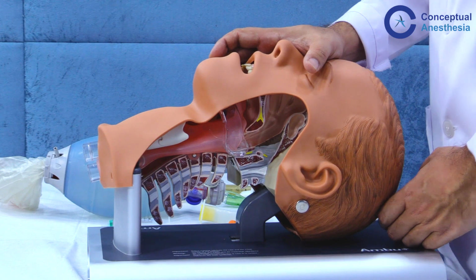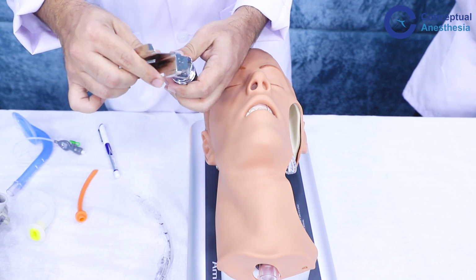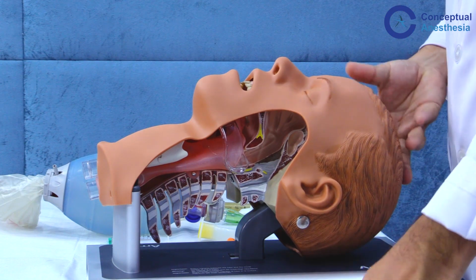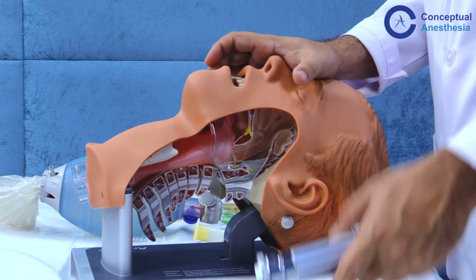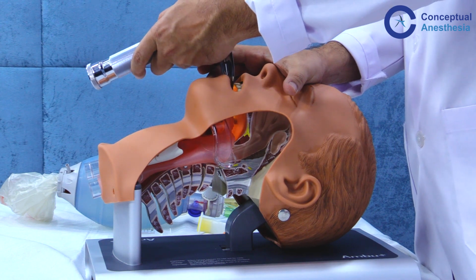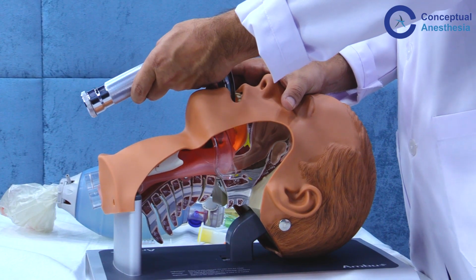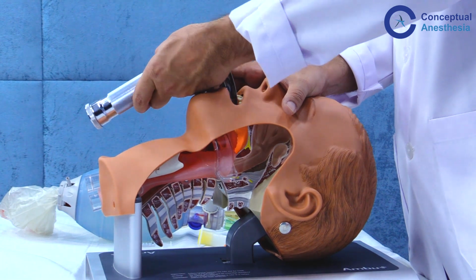Now I take the laryngoscope. I check the light of the laryngoscope. This has to be done prior to starting the operation. Now I introduce the laryngoscope from the right corner of my mouth. Remember, the laryngoscope always has to be held in the left hand, irrespective of whether you are left-handed or right-handed. Once the laryngoscope is introduced in the right corner of the mouth, we sweep it to the left to take the tongue to one side.